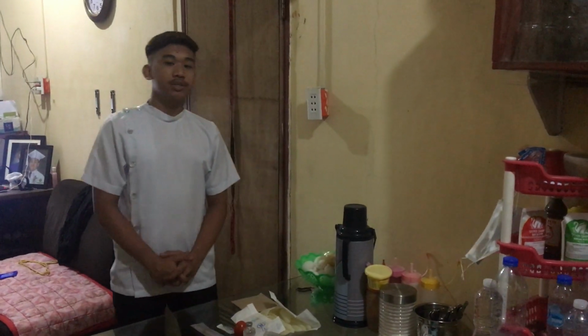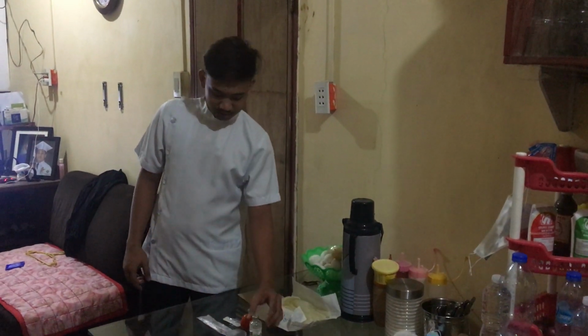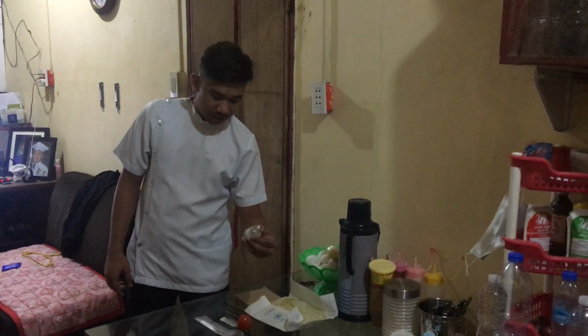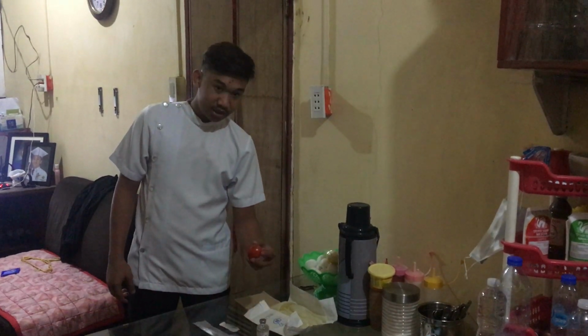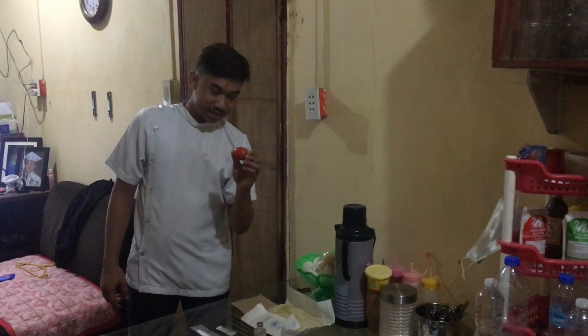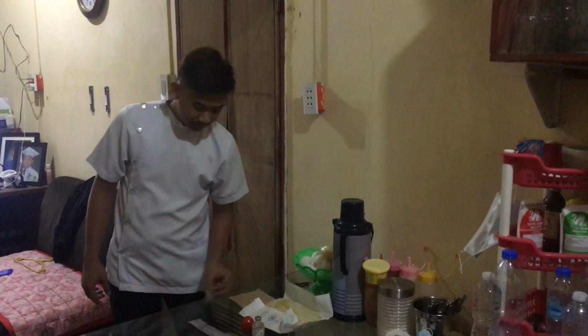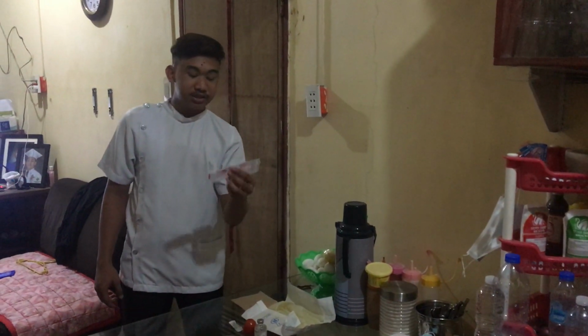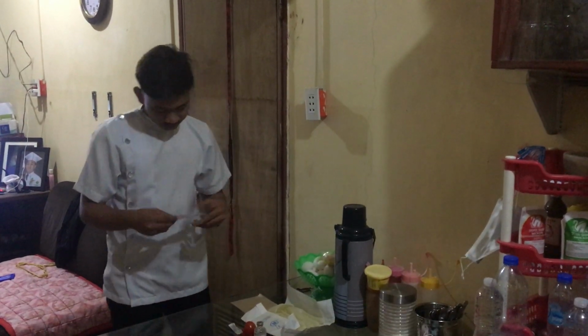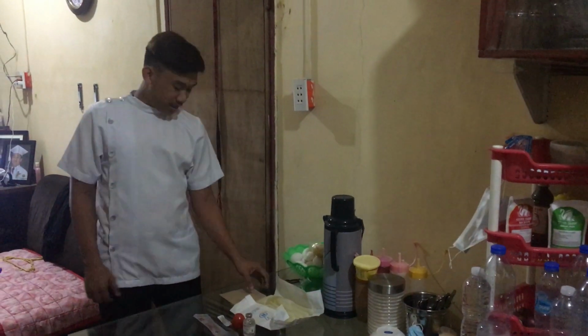The next thing I'm going to do is assemble all of my equipment, which is the gloves, the medicine or the insulin, the tomato which will serve as the patient, and then the aspirating needle, then the 1 cc syringe, and then wet cotton balls, and then the MAR. The MAR, medical administration record.